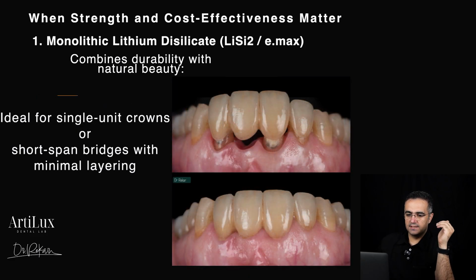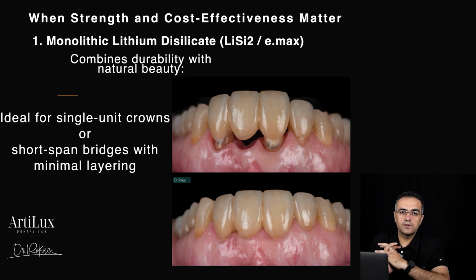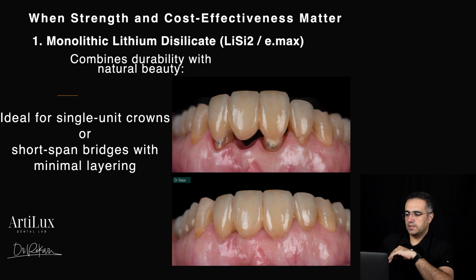And sometimes in these cases, we have only good abutments and only one pontic in the anterior region. So maybe sometimes it's difficult. You can do it with the zirconium oxide, but in this situation, what I did, I just did a very minimum kind of layering. Mostly it is a lithium disilicate bridge. And also we have 1 unit of veneer here.